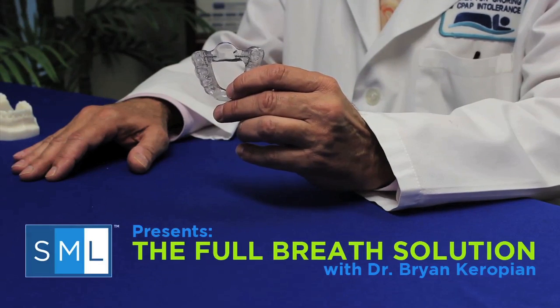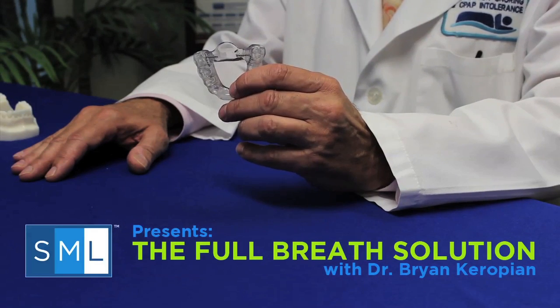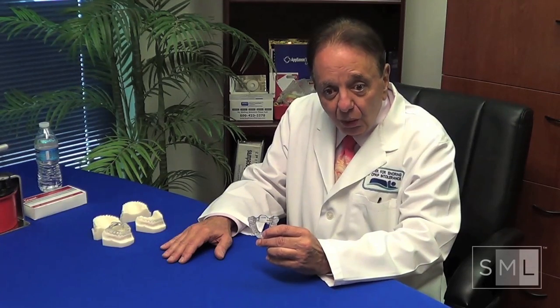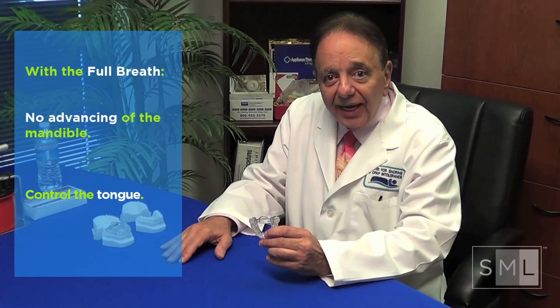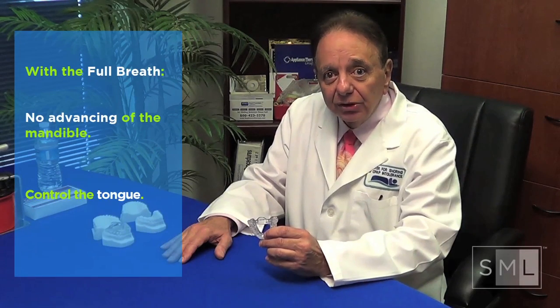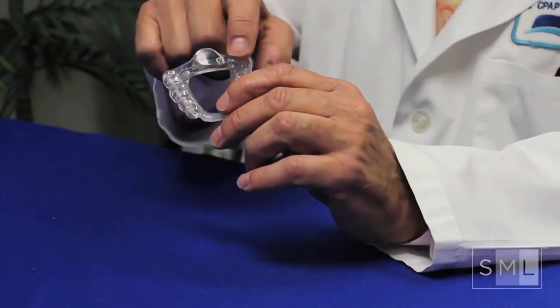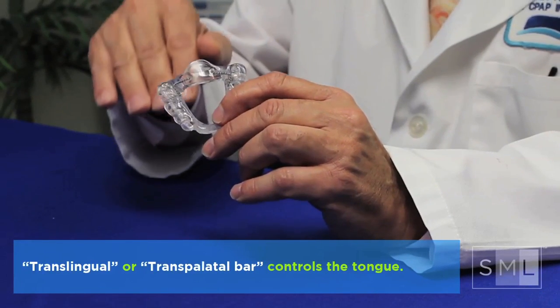I'm Dr. Brian Karopian and we're shooting this video to show you how it can be more effective in your hands. When the Full Breath Solution is seated, it's different than all the advancers. One, we do absolutely no advancing of the mandible. And two, we control the tongue. Whereas the advancers pull the jaw forward trying to pull the tongue forward, we utilize what we call either a translingual or transpalatal bar to control and inhibit the tongue.